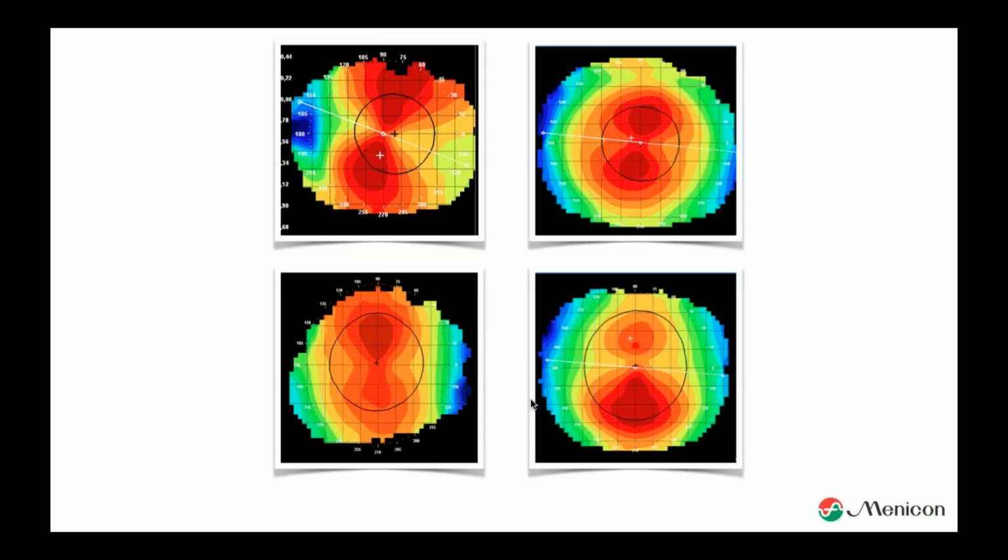Just to keep things simple, in our lens practices in our optical world, we have a name for everything. But what we see here is that we have a central astigmatism, but we also have it in the periphery. In comparison to this one, we have an astigmatism in the center area, but in the periphery there is almost no astigmatism left. So that's what we call a limbus to limbus astigmatism. And the other one is central astigmatism.